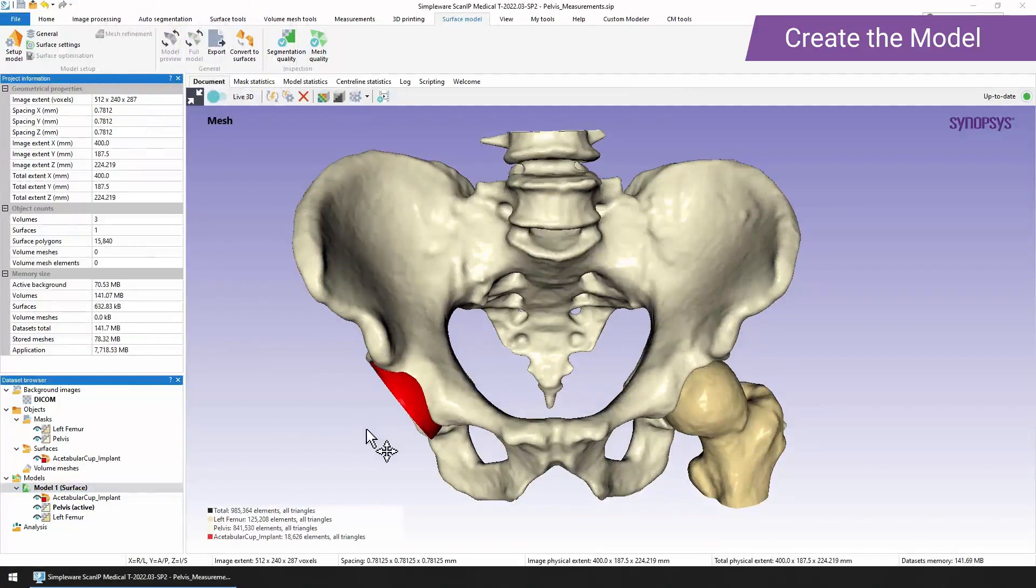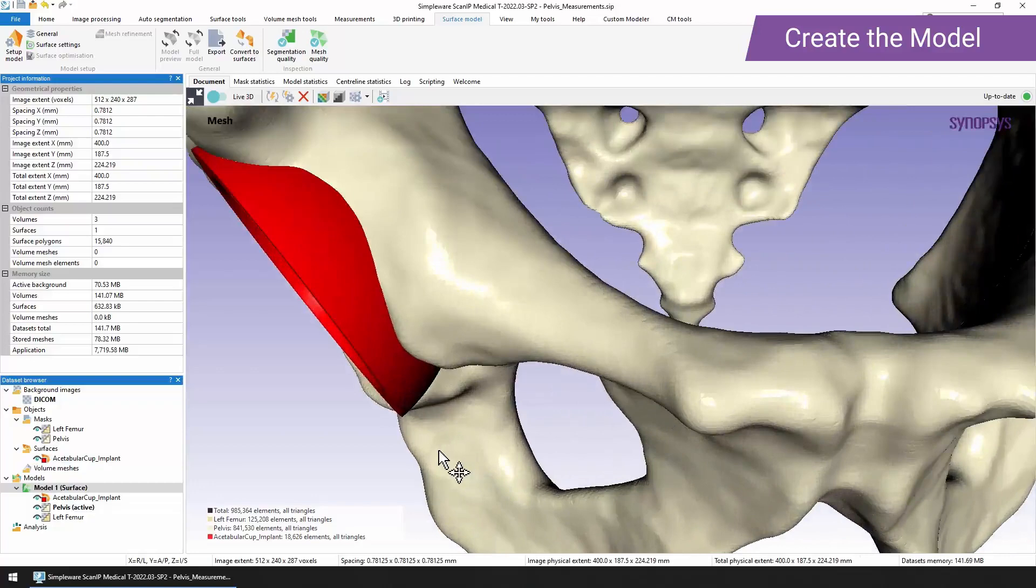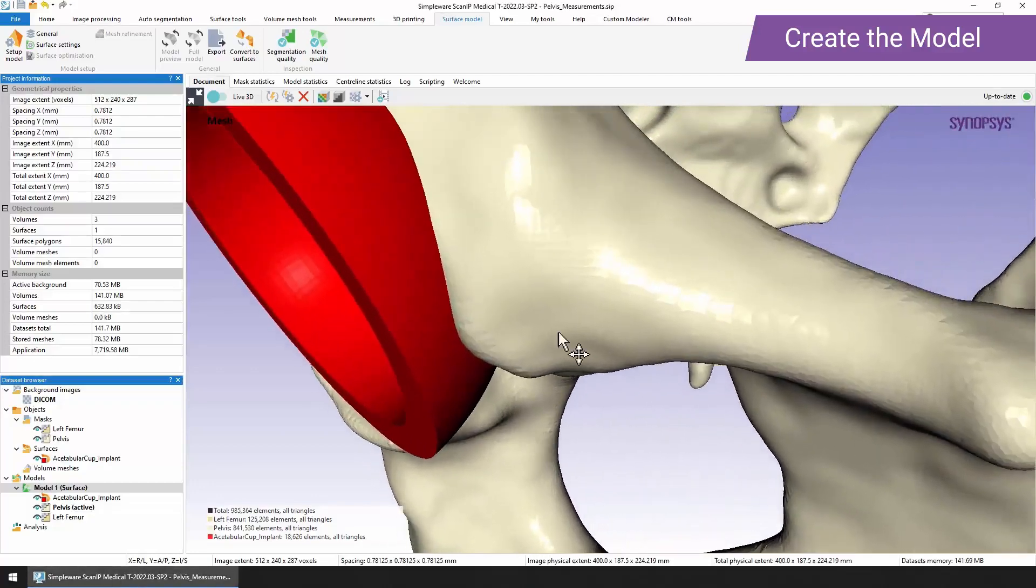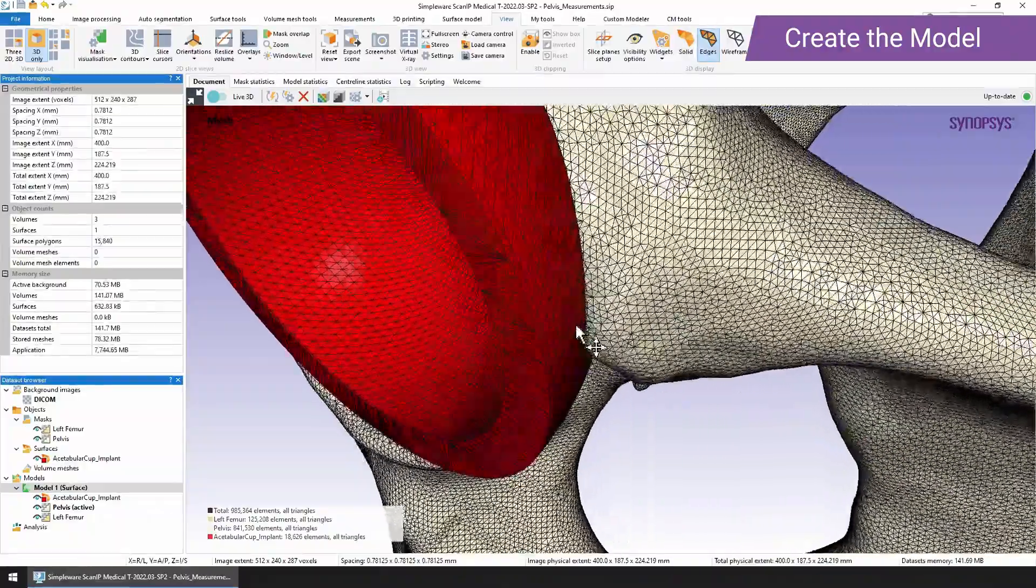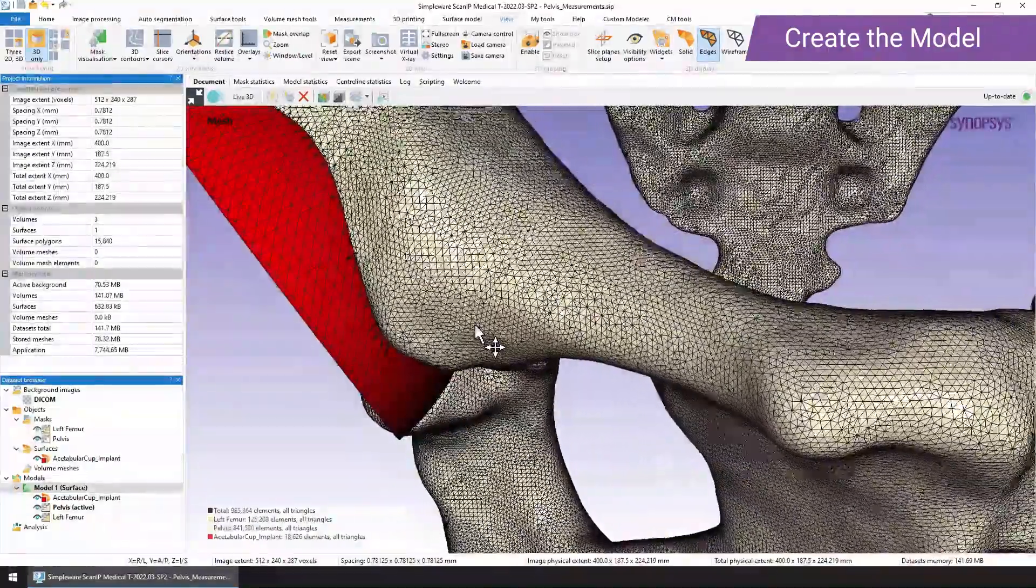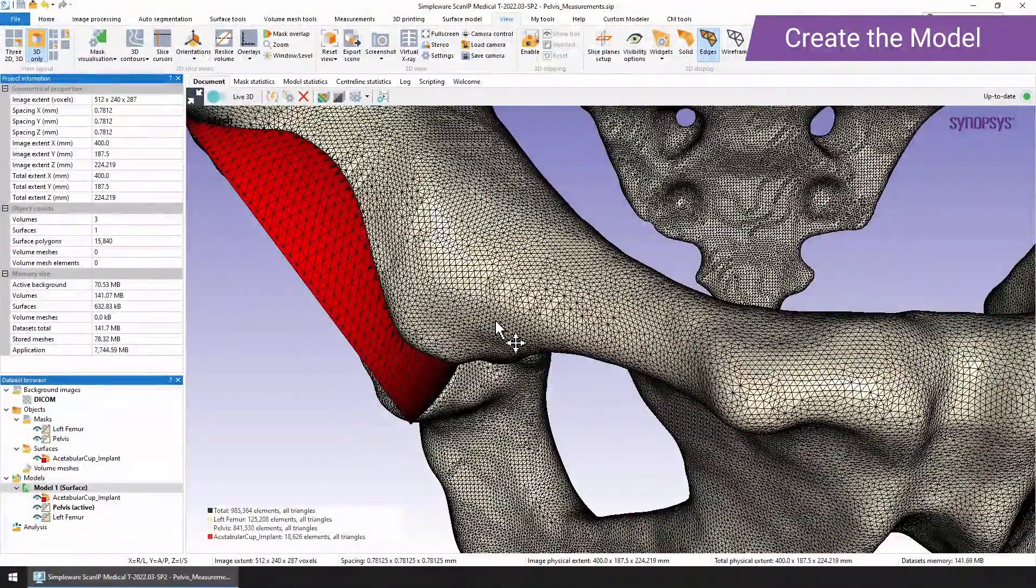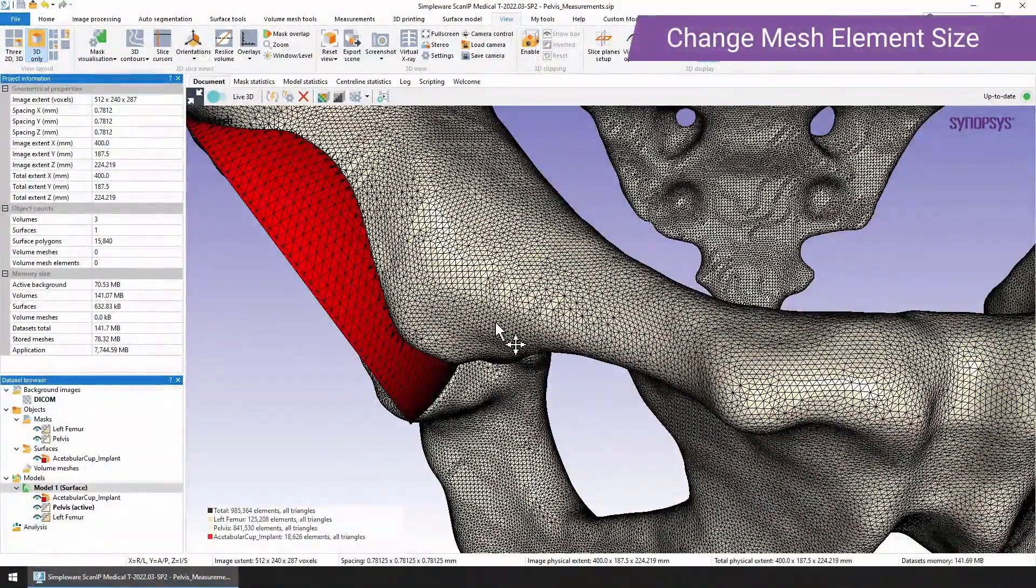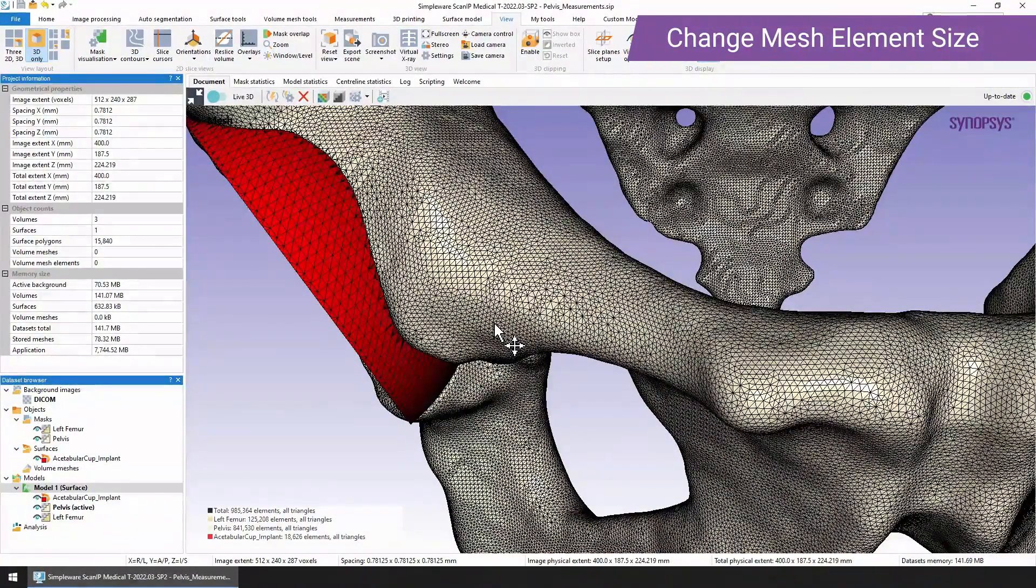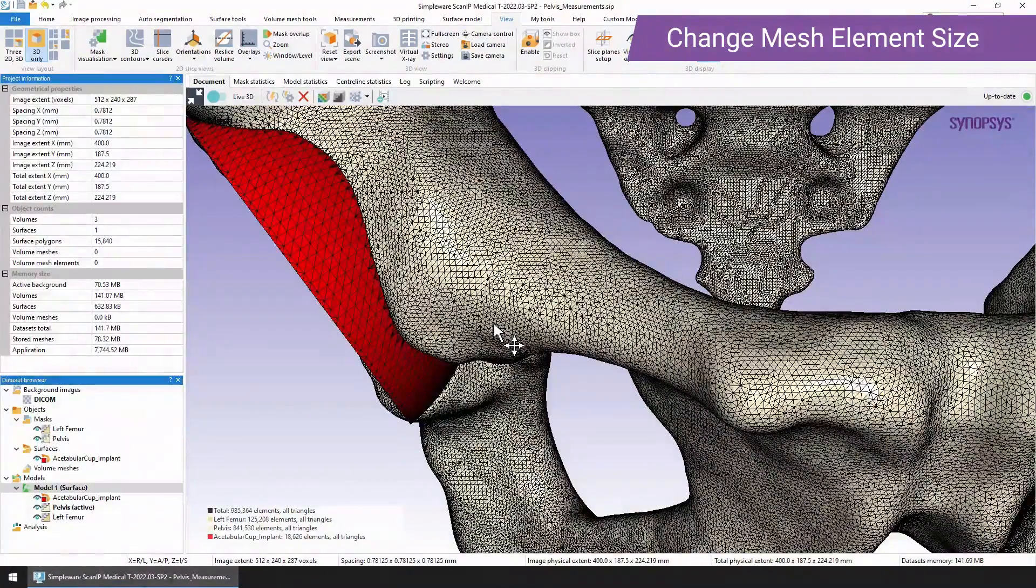Here you can see we've meshed the model now. If we move in very close you can see that we've got a very fine mesh. If I use the edges then you can see that we've got really good representation of the topology of the structure. This is a very high density mesh. But what if we wanted to create something with less elements? We could use that simplistic decimate option.